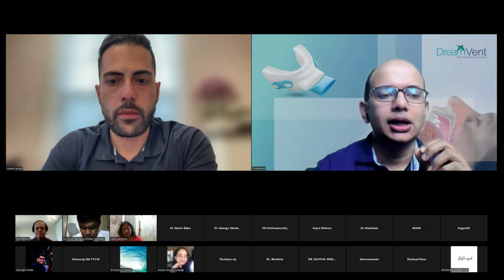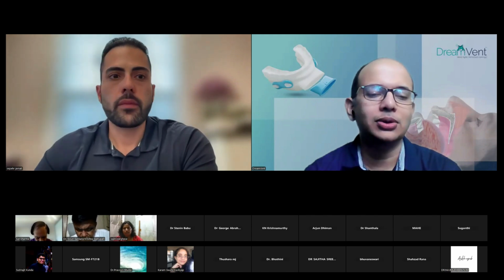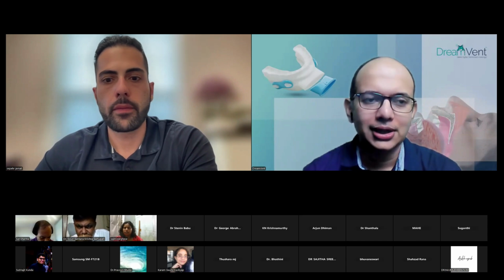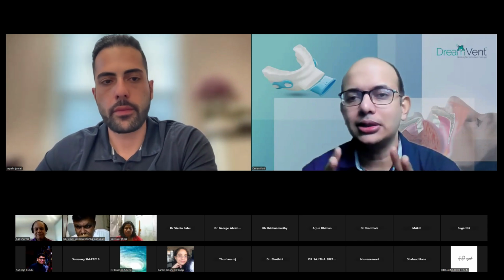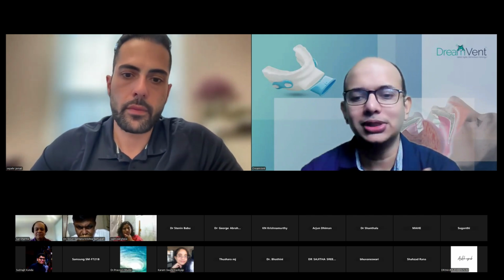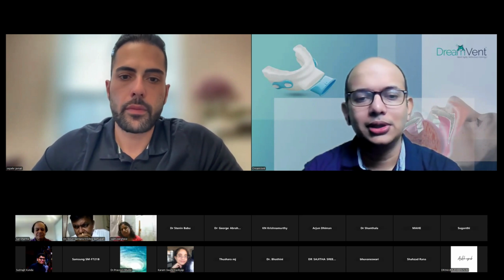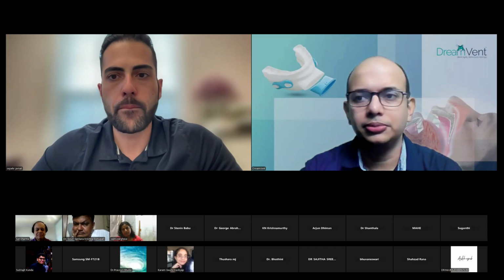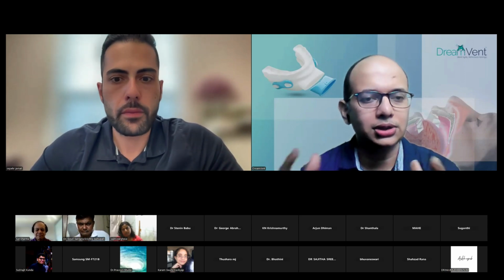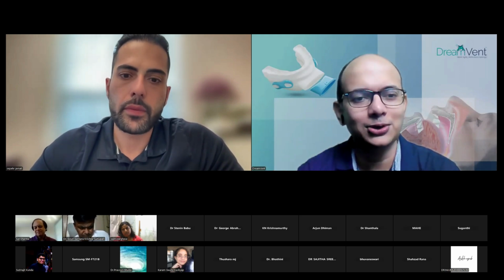Okay. Another general question they've asked is, do we need to keep wearing the appliance, or does it cure OSA? No, in my understanding, the patient needs to keep using it. Even if you're going to use a CPAP, you need to keep using it continuously. Isn't that right, Dr. Jamali and Dr. Sat? You need to keep using it. So there's no other way. Even if you're using a CPAP, you need to use it all your life.